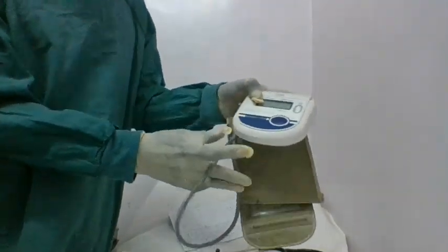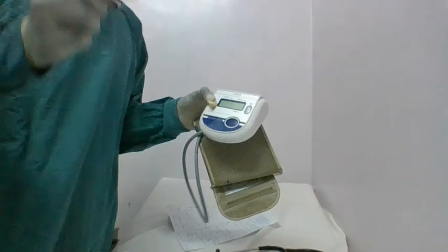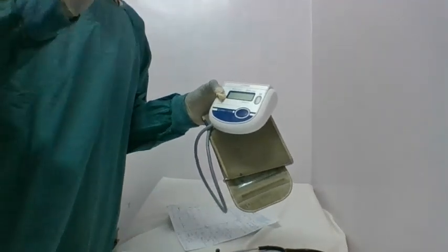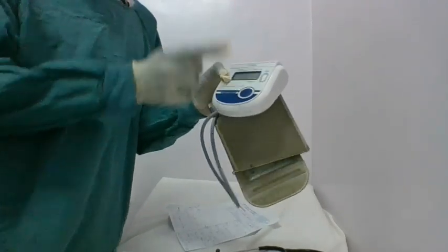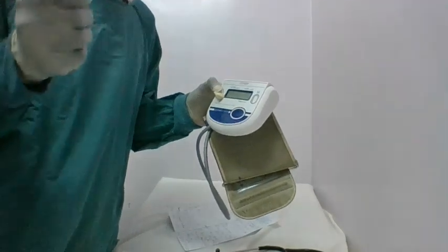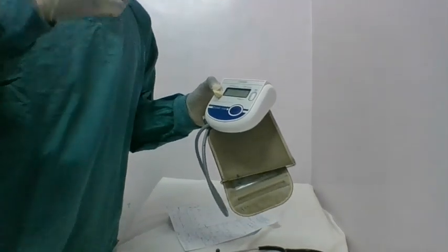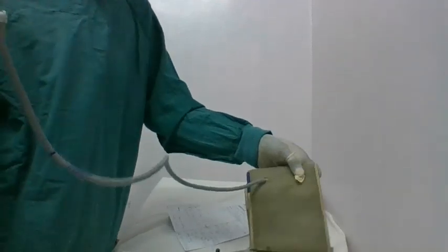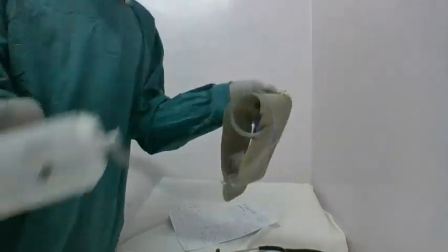And how do you interpret the readings on your blood pressure machine? Basically, you need to know very well the normal ranges of the systolic, the diastolic, and the pulse rates. Always you need to have it at your fingertips so that you can quickly tell when there's an elevation or a decrease in the blood pressure reading of a patient. So guys, you know very well how to use this blood pressure machine. It's very easy to use.